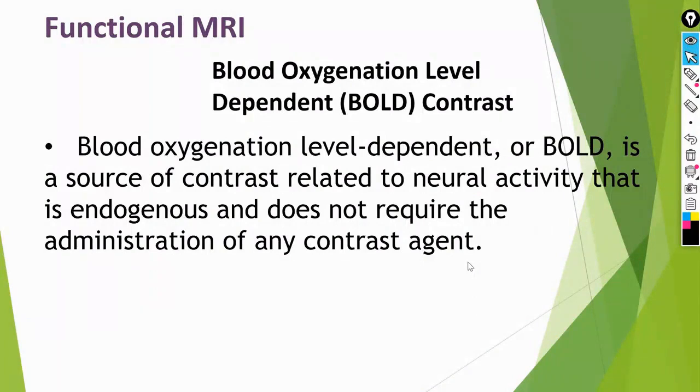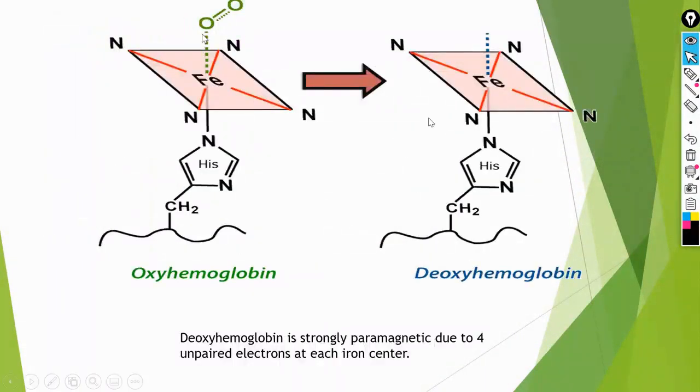In other areas, the ratio between oxygenated and deoxygenated blood is normally close, with only a small percentage difference. So when there is stimulation to a specific area in the brain, blood flow increases, leading to a higher proportion of oxygenated blood, which contains oxygen. This is the form of oxyhemoglobin, while deoxyhemoglobin is the hemoglobin that is not bound to oxygen.